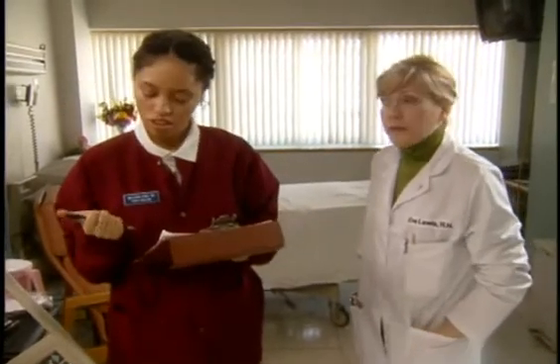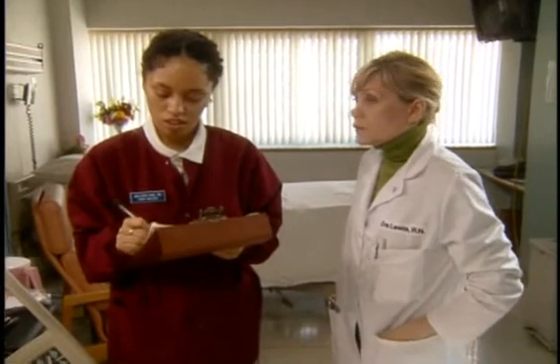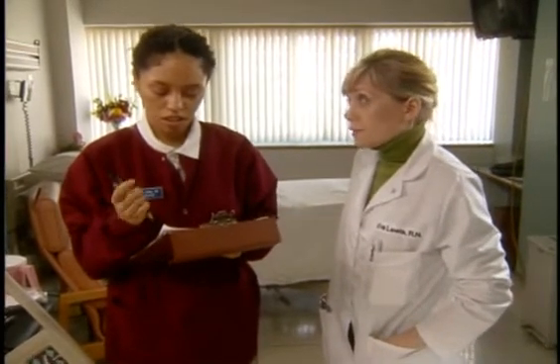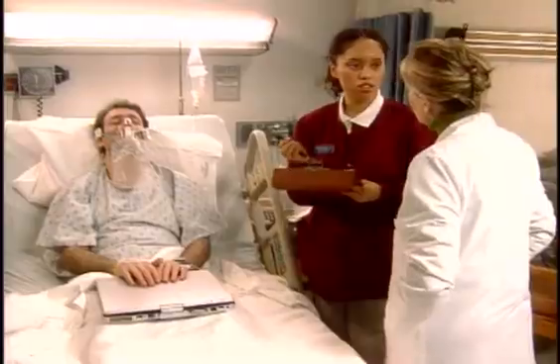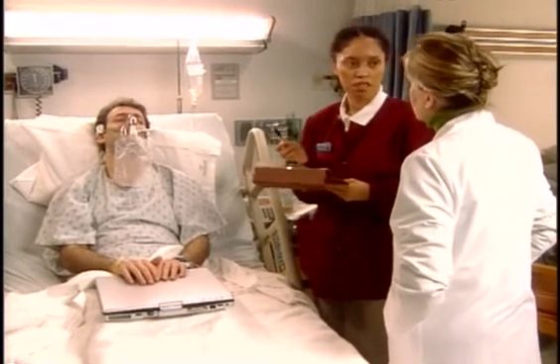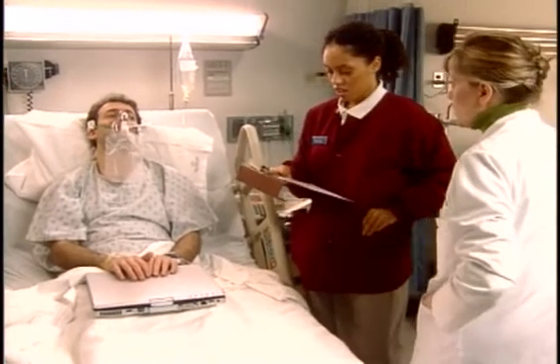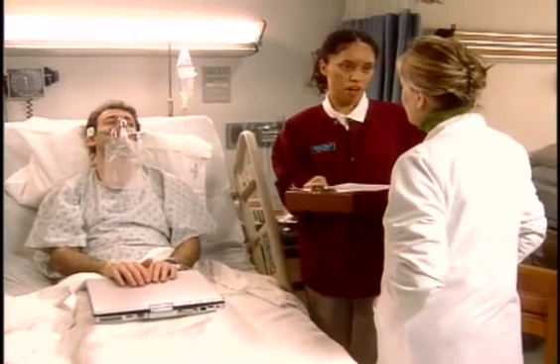Great. Now, skin integrity can be compromised due to moisture and pressure under the mask. So regular assessment of the area under the mask is an important part of care. Right, so I'll remove the face mask and dry the skin every 2 to 3 hours and check for any skin irritation. Good. And powder should never be used around the mask. Got it. Won't touch the powder.